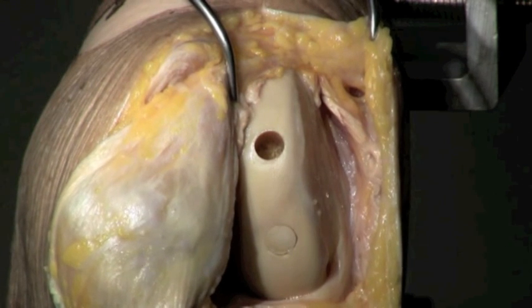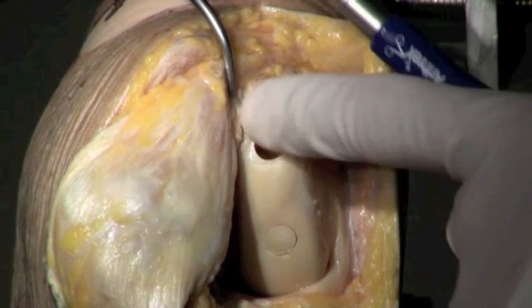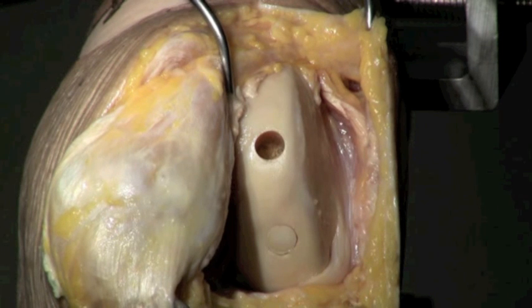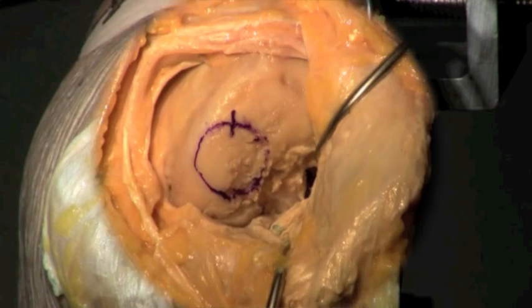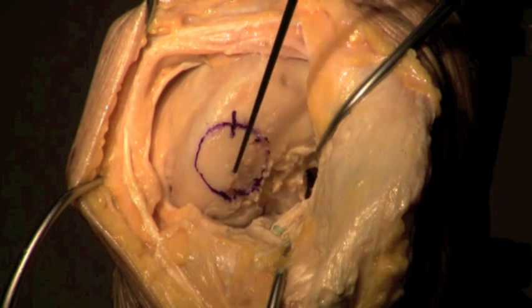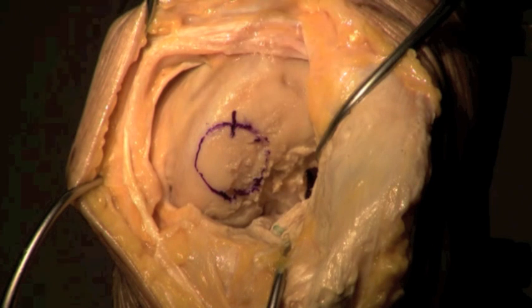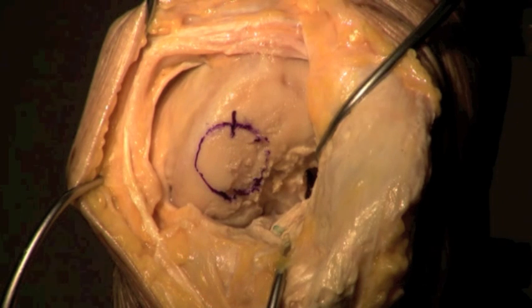And now I will take what's left of the bone that we took out from this spot here, and we will backfill that into the defect that we created. So this is the standard OATS technique that you may have heard or read about, or we may have talked about in the office, in your particular case. So we've marked here the 20 millimeter recipient site where we've got all this wear and all this big injury, and I marked the north so I know which of the quadrants we are, so when I match our donor up to this, I know which side is up and which side is down.